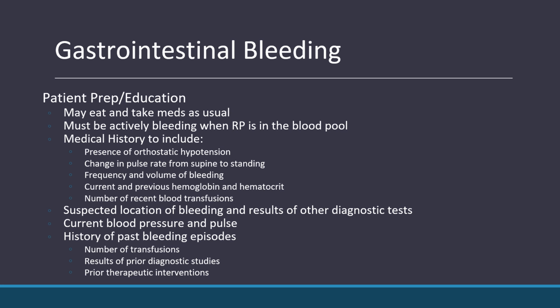I do want to say, as far as contraindications go, you also don't necessarily want to do the test if somebody is actively receiving a blood transfusion. That can get a little tricky. You never ever want to draw the blood from the blood bag. You always want to draw it from the patient to be tagged. And then if you are injecting the tagged radiopharmaceutical, you just don't want to use transfused blood for that because there can be other things in there to preserve the blood that keep it from being able to tag to the radiopharmaceutical.